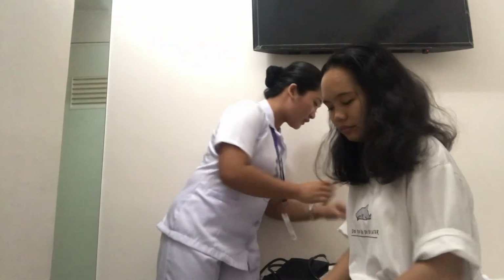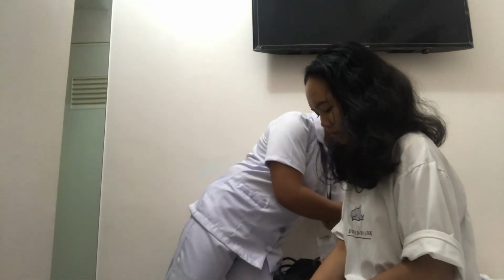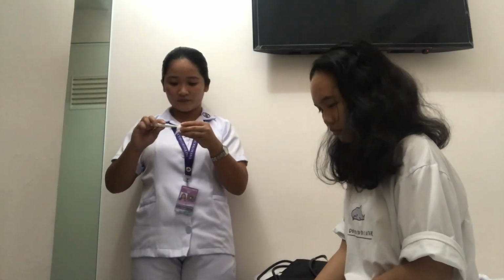Yes. So since I'm going to use the digital thermometer, I'm going to disinfect it first by wiping the tip of the thermometer with alcohol in a firm twisting motion. Then I'm going to place it on the posterior sublingual pocket within my patient's mouth.